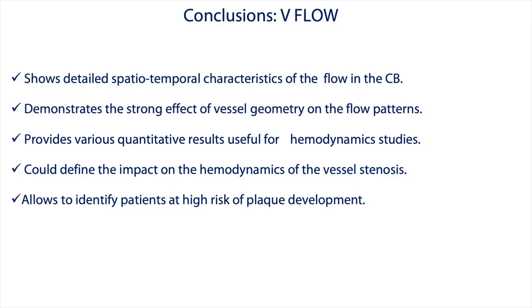Based on what we have seen, let me come to some conclusions. VFlow shows detailed spatiotemporal characteristics of the flow in the carotid bifurcation and demonstrates the strong effect of vessel geometry on the flow patterns. It provides various quantitative results useful for hemodynamic studies and could define the impact on the hemodynamics of the vessel stenosis. And last, VFlow allows to identify patients at high risk of plaque development.